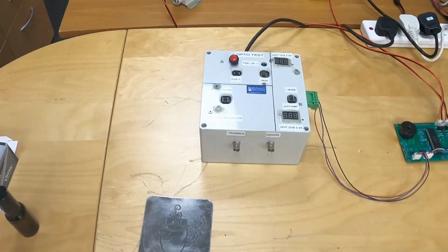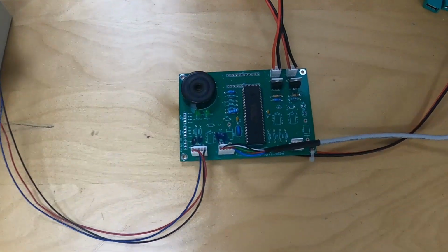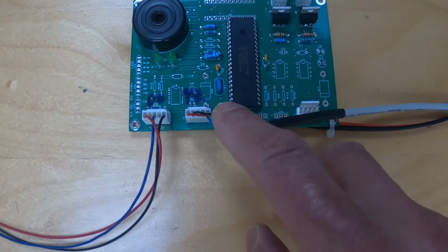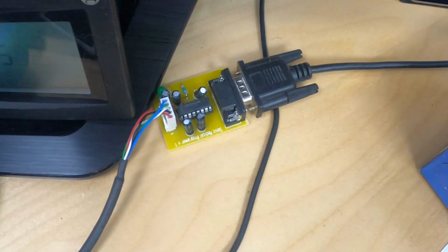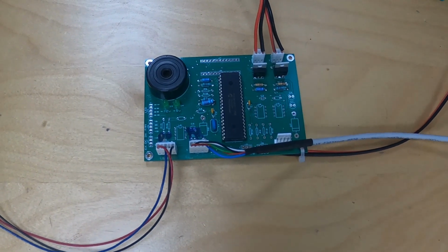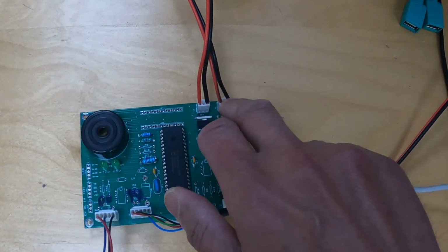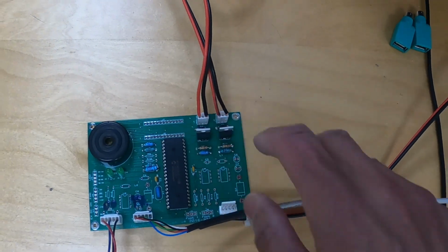Let's have a look at this. Got my +5 +12 volt power supply, going to our new PCB which we just built. This is the ID interface from my little serial to TTL converter there, which we can then program in real time for debugging purposes. We've got our two outputs for solenoid 1, solenoid 2.